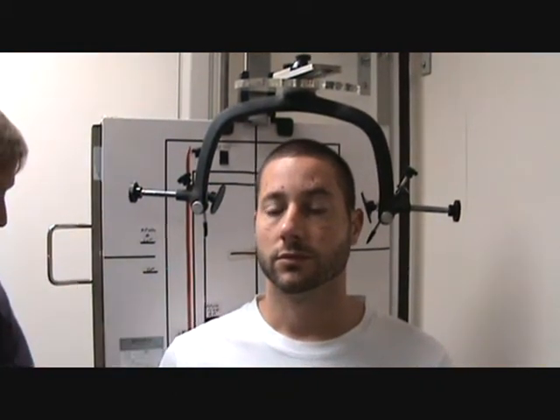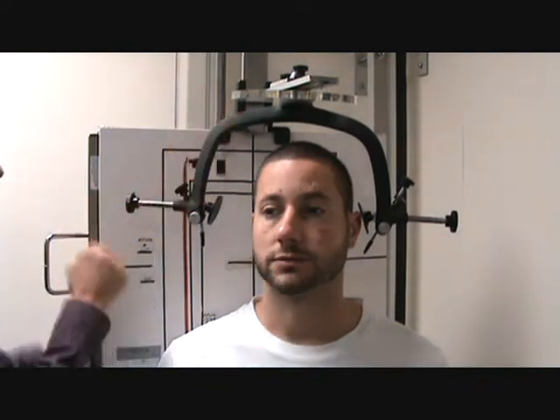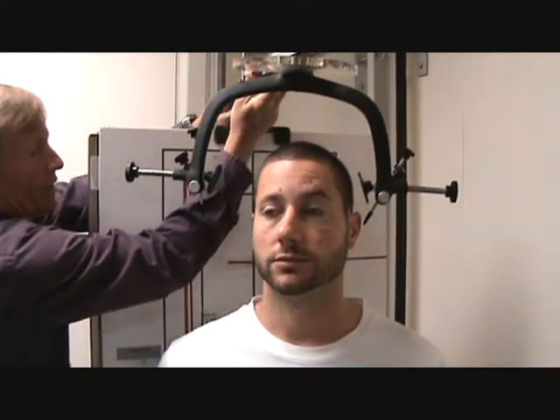Let's go ahead and bring our patient into position. The patient will have hands on the lap, sitting up straight and tall, looking eye level straight ahead. We're going to approximate the bucky center to where it would be if we were coming through these points — we'd like to hit it about the center — so we'll drop this down and raise the head clamp up. Once it's turned to 26 degrees, we'll put the patient's shoulder nearest the bucky to the bucky until it touches.